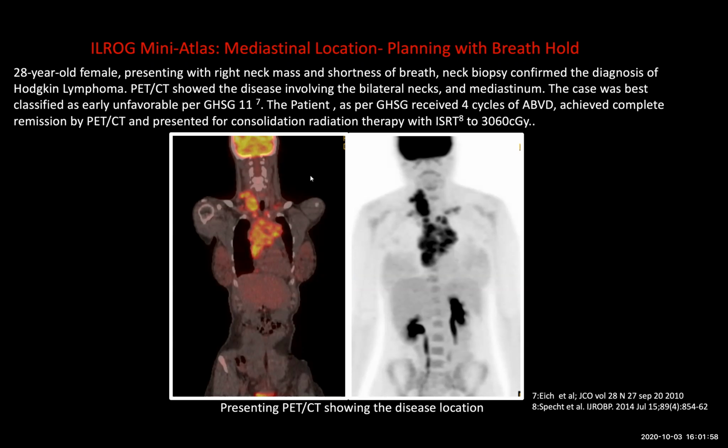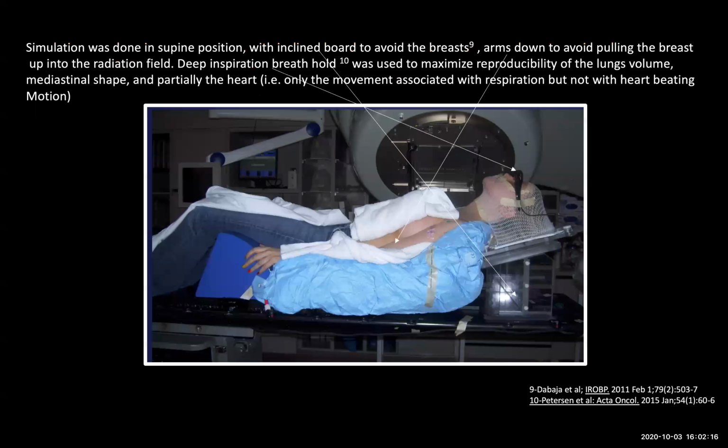And she received 4 cycles of ABVD, did achieve a complete remission by PET scan criteria, and now presenting for consolidation radiation therapy. Although the dose mentioned here is 30.6, quite often we use 30 gray since that fits more with the HD11 doses.